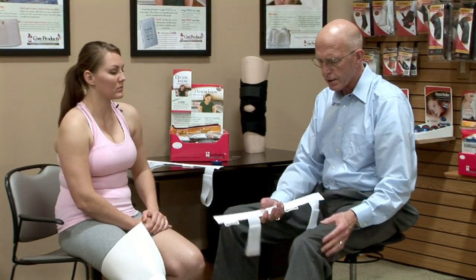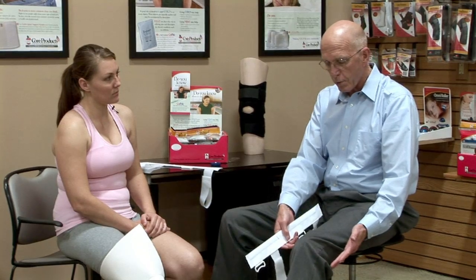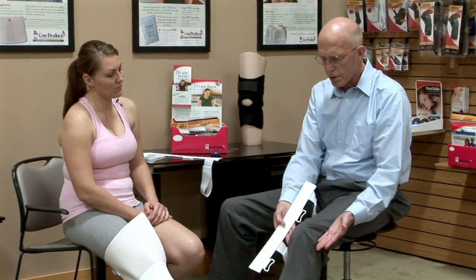The nice thing about these is if this is put over dressing and the leg is swollen, we can still place it here. A day or two later, a week or two later, we can take these off and reposition them. If the dressings come off and the leg gets smaller, we can reposition this so it's always to the outside and always to the very inside.